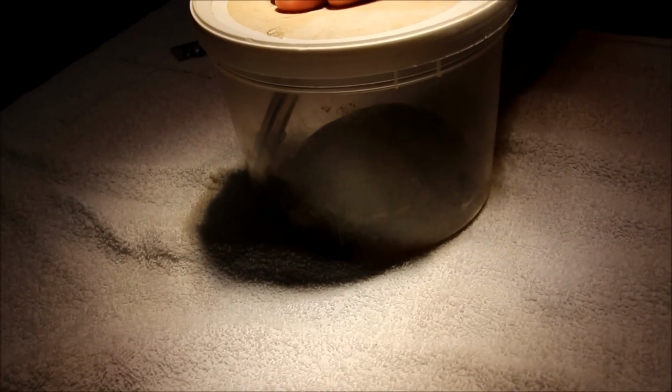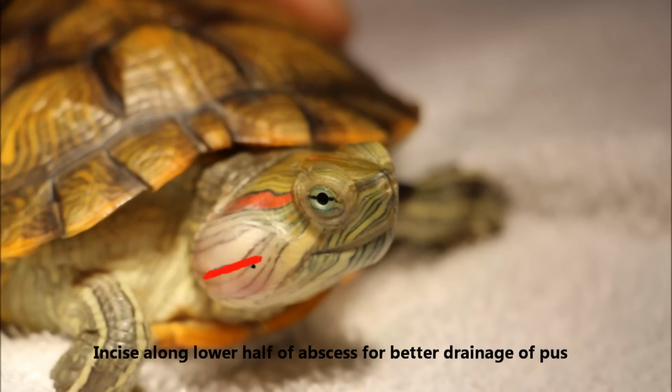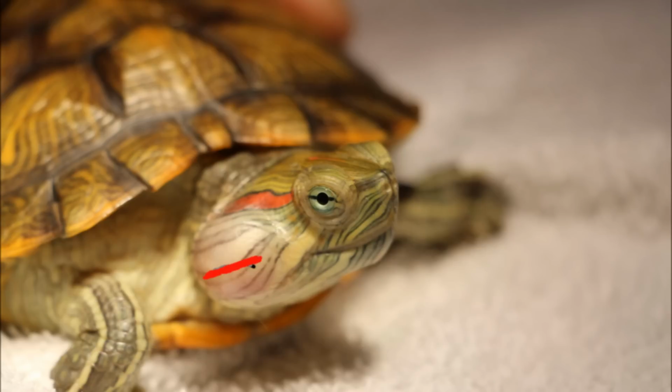Secondly, we shall lance or pierce the abscess. Using a scalpel, a 5mm wide incision was made along the abscess. This was made on the lower part of the abscess in order to allow for better drainage of the pus contained within. Let us now watch real-life footage of the lancing process.